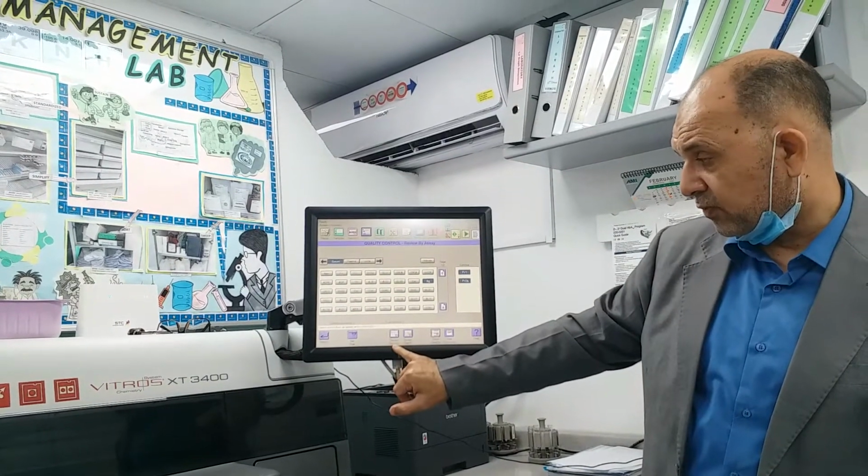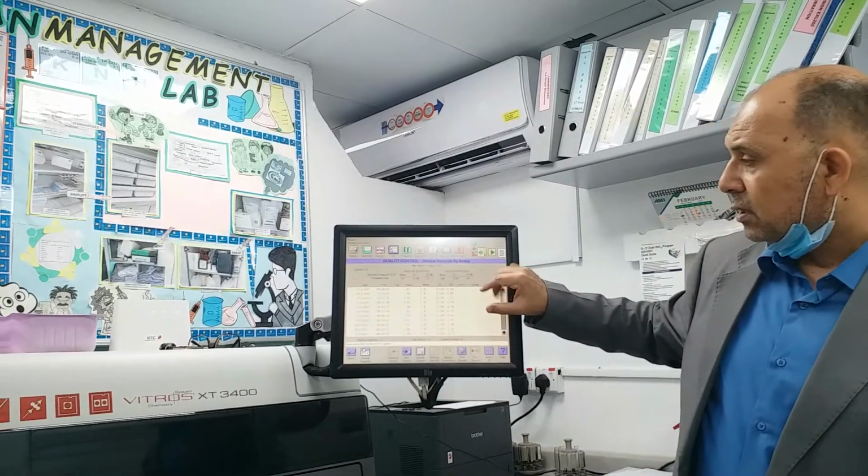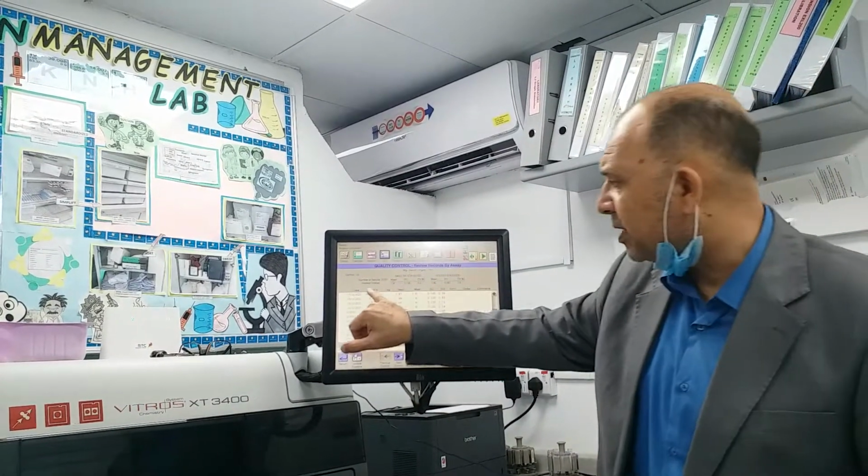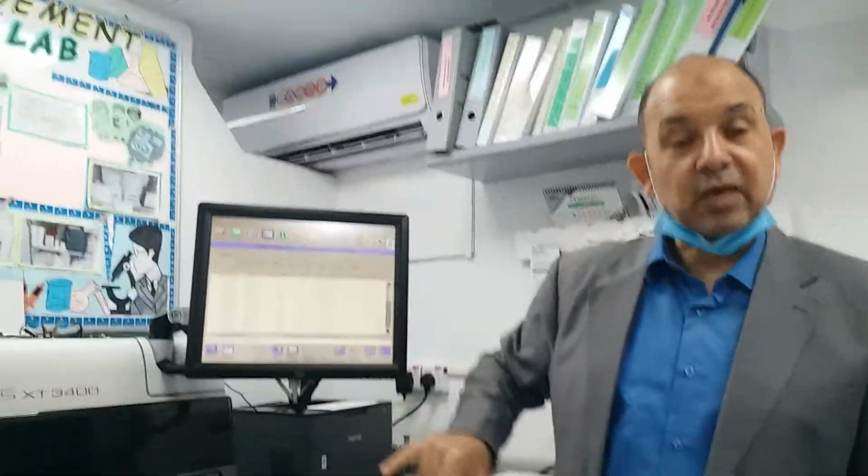Now, from here, the previous or the check record, I find here how many results you have: 31 results. Okay. So can I print all these results in one page? Of course I can.